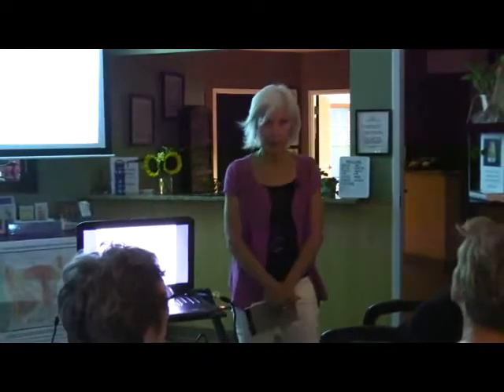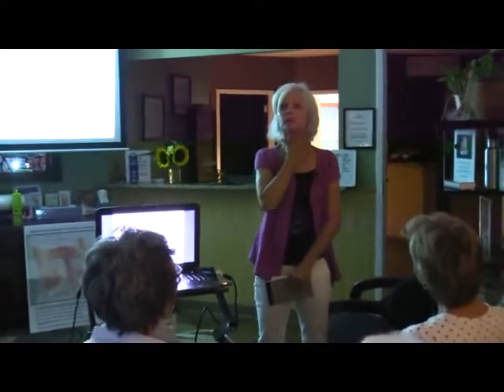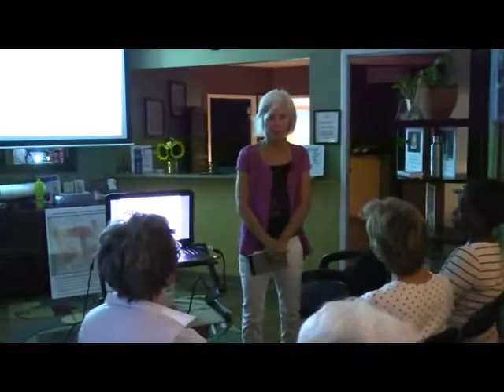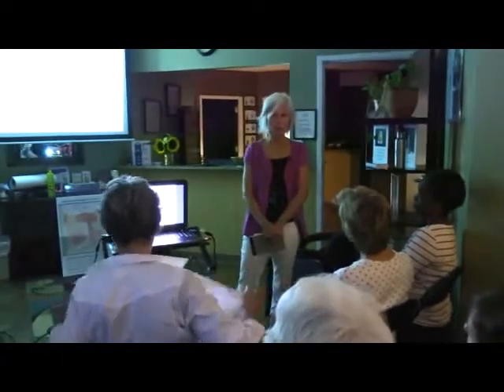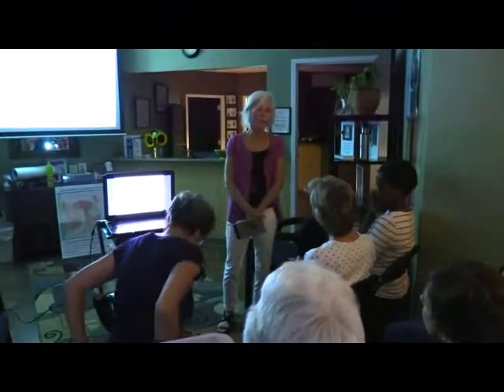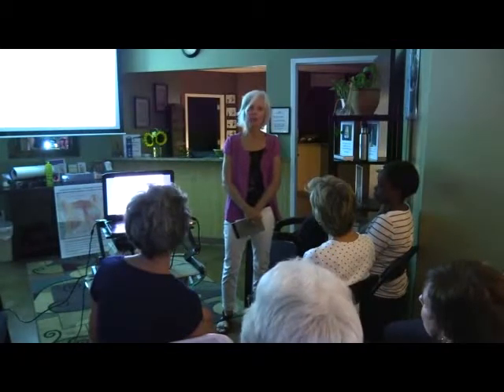A doctor who is in tune with thermography can pick that up, yes. This area always runs hot. Every woman has red here, usually, to varying degrees. But with subsequent thermograms, if anything changes in this area, I have known that it can pick up thyroid issues. It has very few medical applications, as I mentioned earlier, because it doesn't go inside. But with something like the thyroid, if someone who knows what they're doing can look at this and compare images, they could pick up something. And I've heard that that can happen.